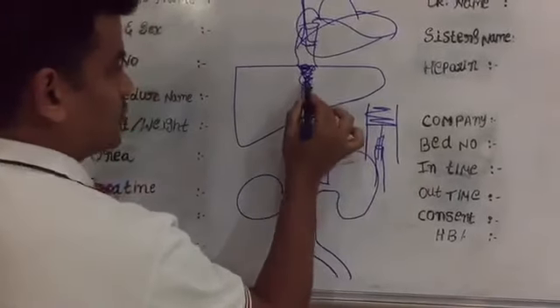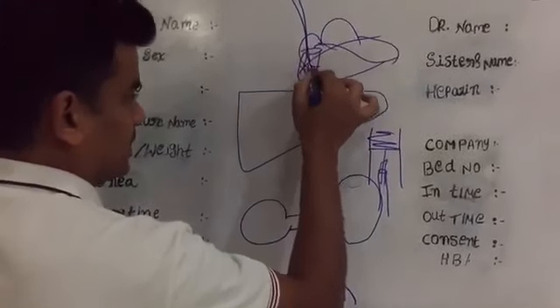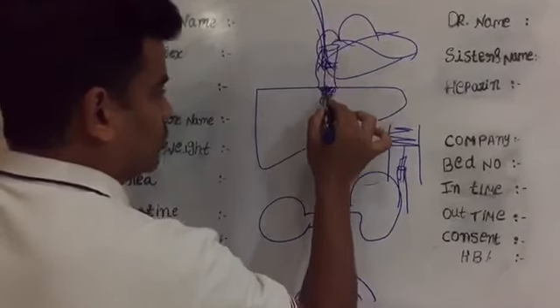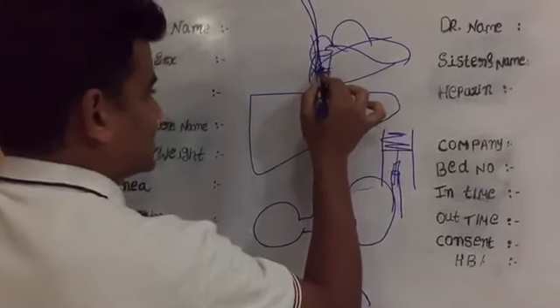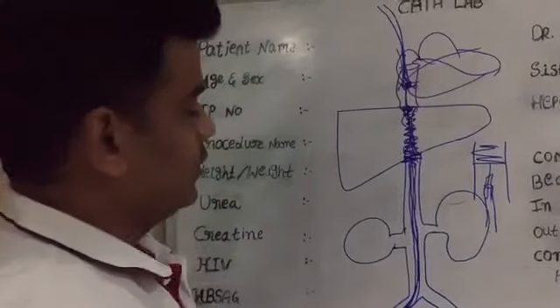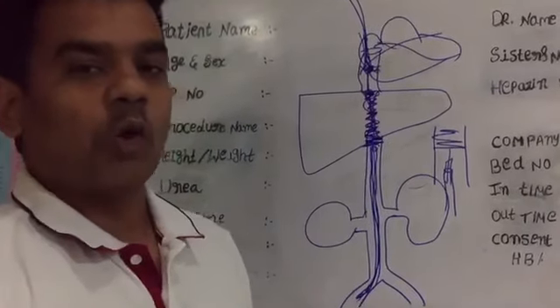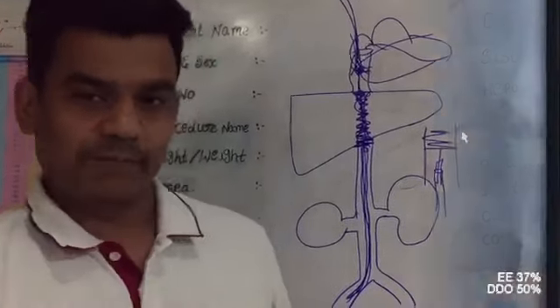Then try to target with the Chiba and meet that long sheath and the catheter that you have put here, go through this occlusion all the way, catch this and get inside that. So we are going to demonstrate a case, how we do that special technique, especially to recanalize those chronically occluded IVCs resulting in Chiari syndrome. That's going to be interesting.